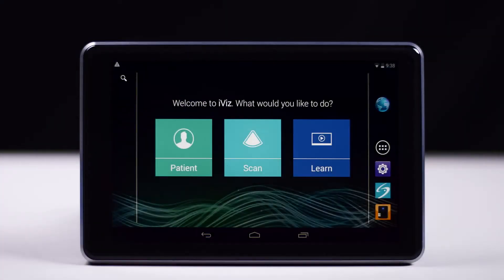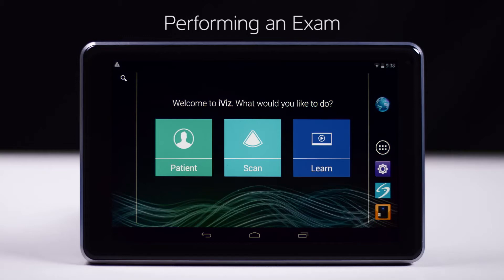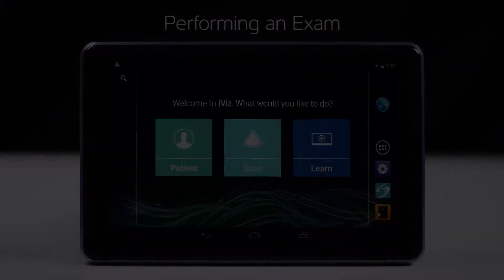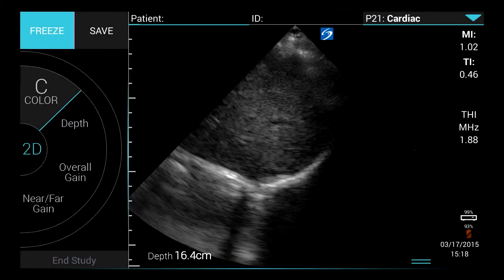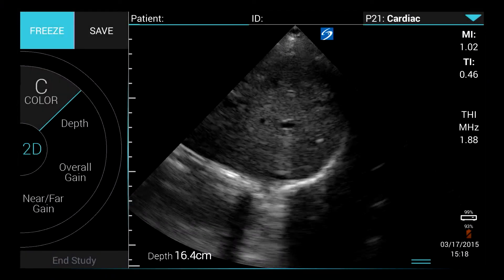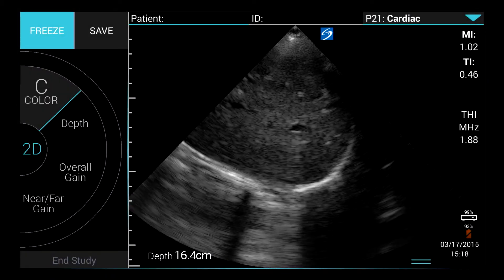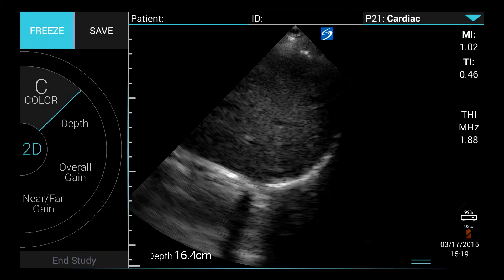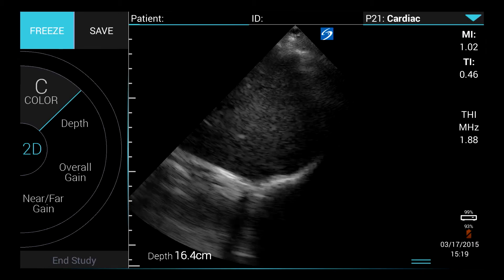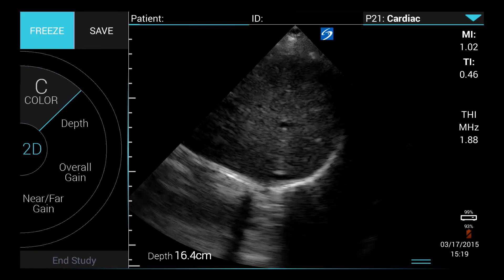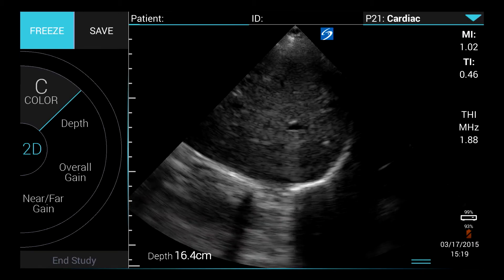Welcome to the help video, Performing an Exam. In this video, we will explain how to select an exam type, adjust parameters such as depth, overall gain, near and far gain, and optimization.